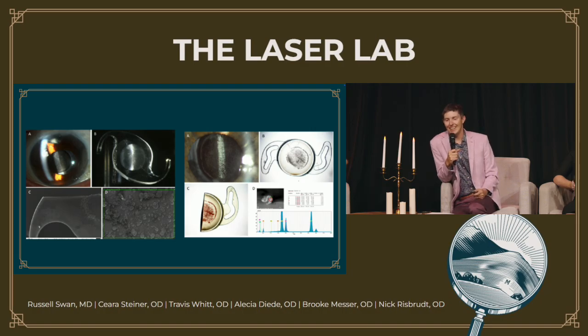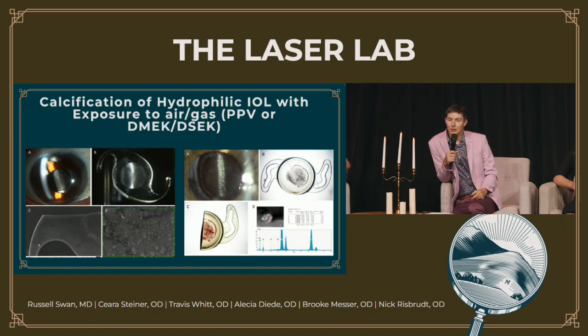Yeah. This is a super rare thing to see, but it's also another one worth noting. This has been described with silicone lenses. It has been described with hydrophobic acrylic lenses, but it's been very well described with hydrophilic acrylic lenses. And this is a calcification of a hydrophilic lens in association with intraocular gas. And we actually see it in 2 situations.